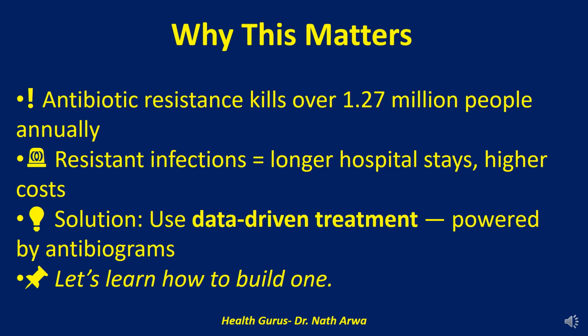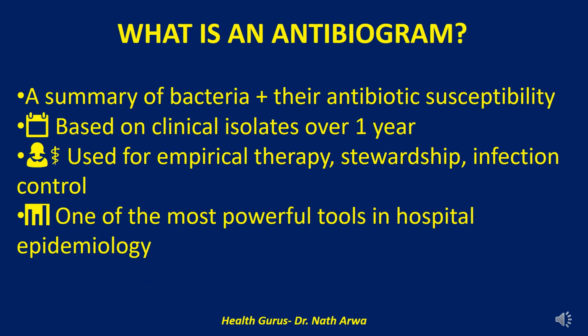An antibiogram is more than just a report, it's a life-saving tool. It empowers hospitals, doctors, and entire communities to use the right drug at the right time, for the right bug. So if you're ready to make a real impact, whether you're a healthcare worker, microbiologist, student, or just curious, stay with us, because in this video, you'll learn exactly how to build an antibiogram, step by step.